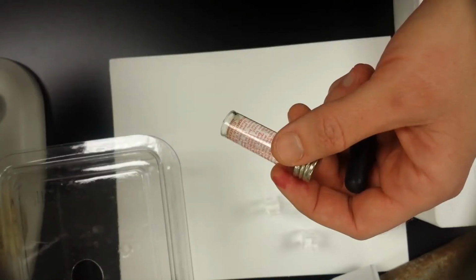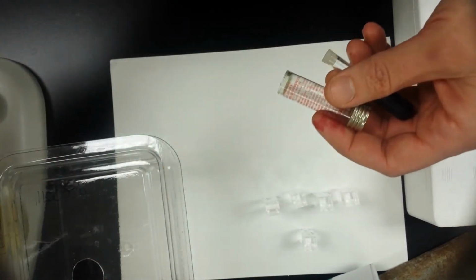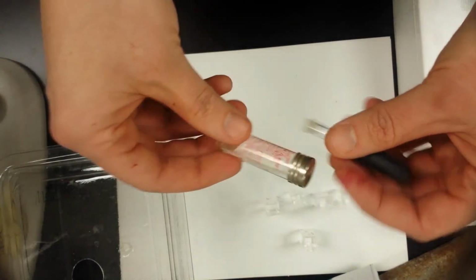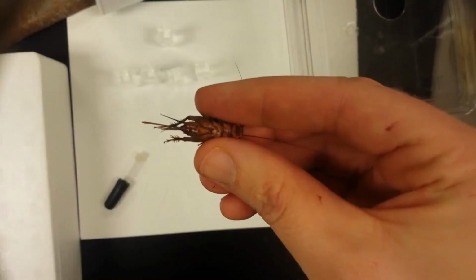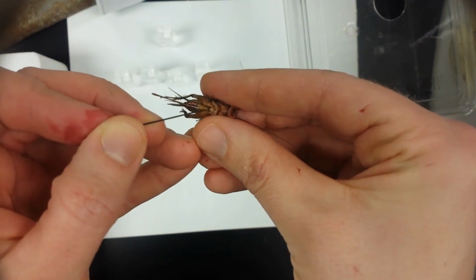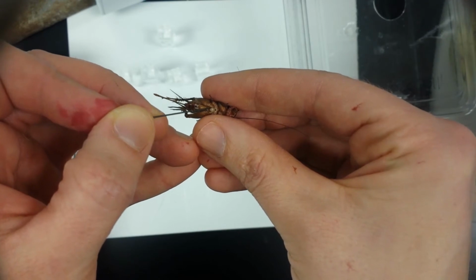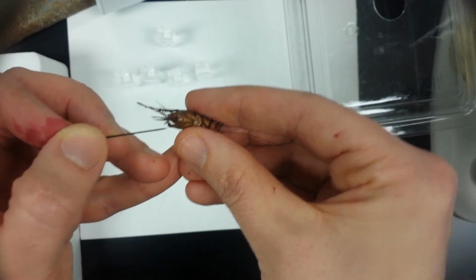Let's see if you can see that up close. There you are. Okay, so then for my next parlor trick, I'll poke the crickets again using one of these insect pins, and then I'll take a blood sample using one of these microcapillaries. This is similar to what you saw for taking crayfish hemolymph samples. Okay, so here again is one of the crickets that I injected earlier, and what I'm going to do is take this pin and poke her right at the base of her hind leg, and then if I hold her just right, I'll see a little bead of hemolymph appear there, and then I'm going to stick the microcapillary up against that to collect the hemolymph sample.